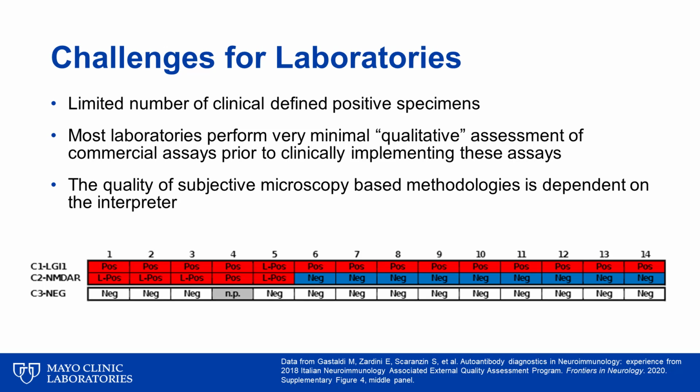When a positive confirmed case was shared with these 14 laboratories, only 5 of the laboratories properly identified the NMDA staining pattern. The challenge here really lies in distinguishing non-specific or pattern mimics from the real staining. And this is particularly challenging for the NMDA receptor.